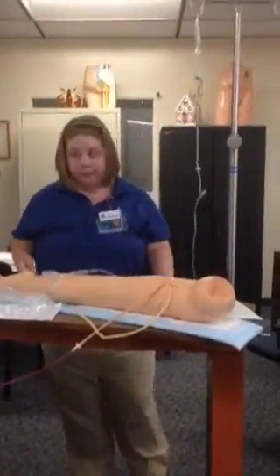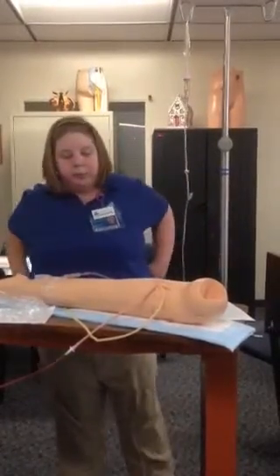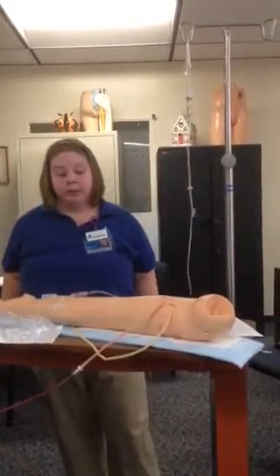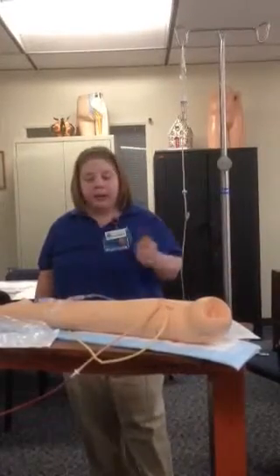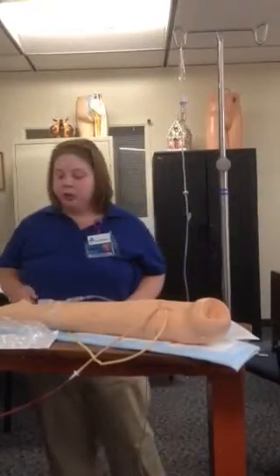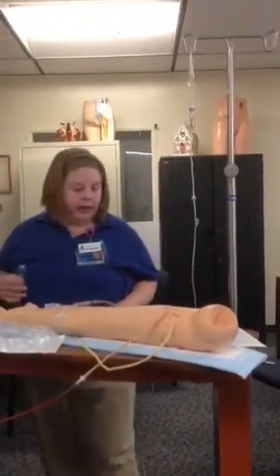I'm checking my 4 Ps. I'm making sure they have had no type of reaction. This is infusing over an hour, so I'm going to come back in an hour, make sure my medication has infused. I'm going to make sure no reaction has occurred. I'm going to check the patency of their line again.